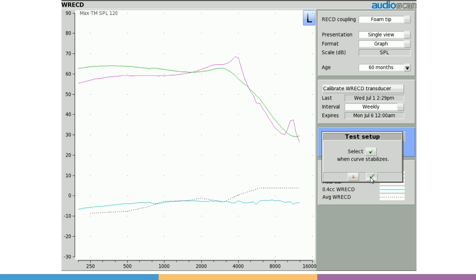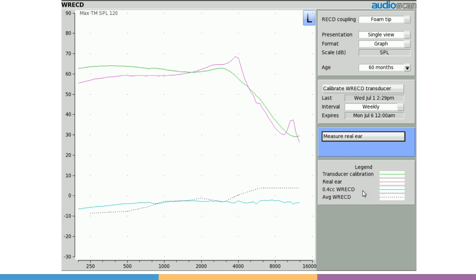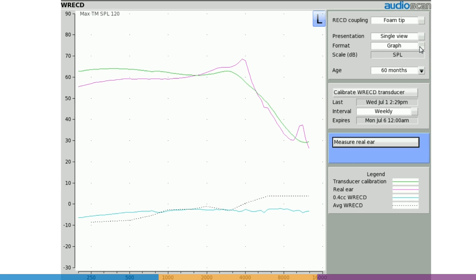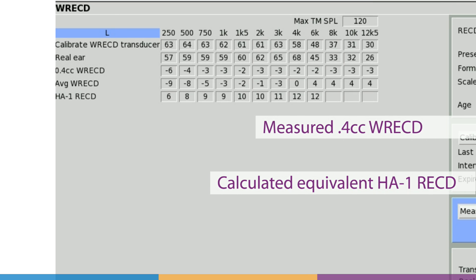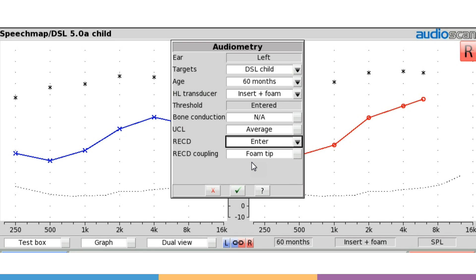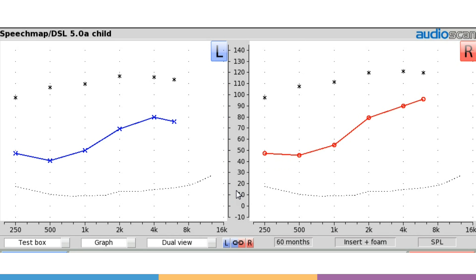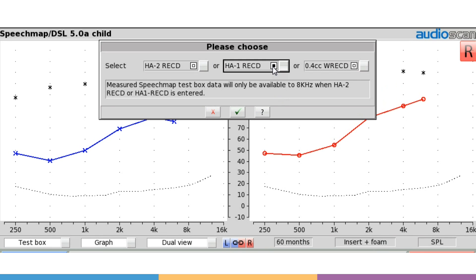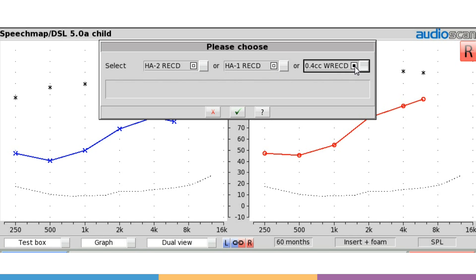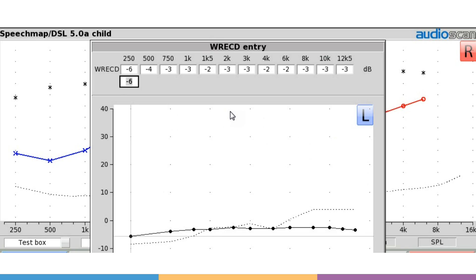The Verifit 2 will always measure and use a 0.4 cc WRECD. But for compatibility purposes, an HA1-referenced RECD will be calculated automatically. This can be used in cases where the RECD will be entered in other equipment. When entering previously measured values on the Verifit 2, the coupler reference must be selected: HA1 for other models using current software, HA2 for older software, and 0.4 cc for re-entering WRECD measured on the Verifit 2.